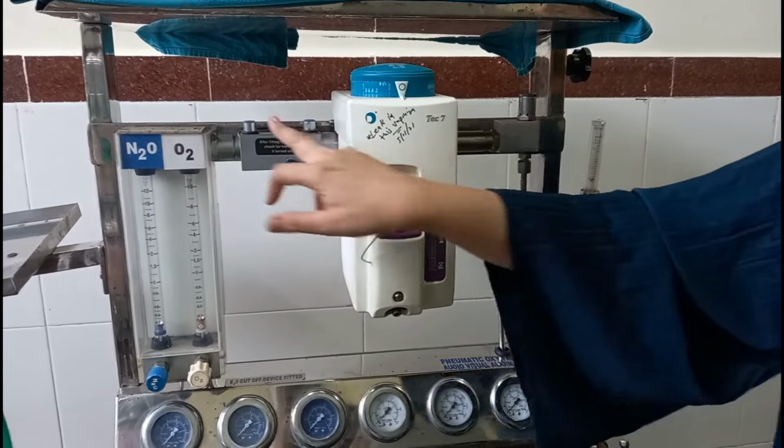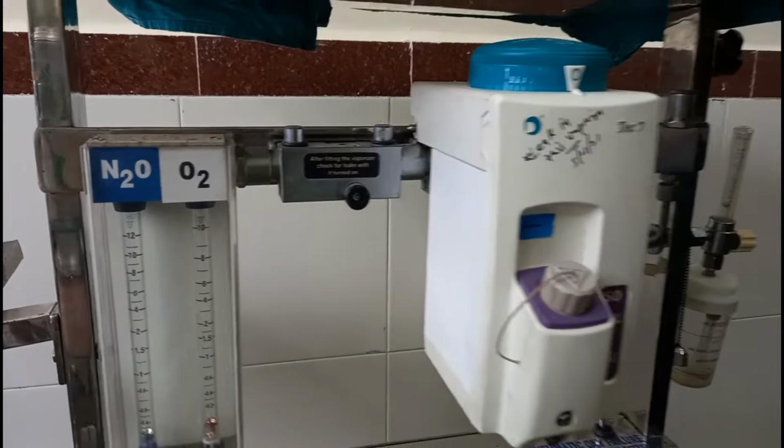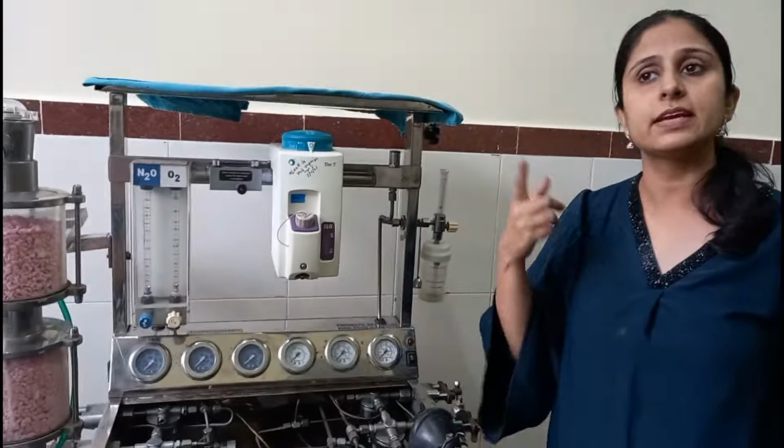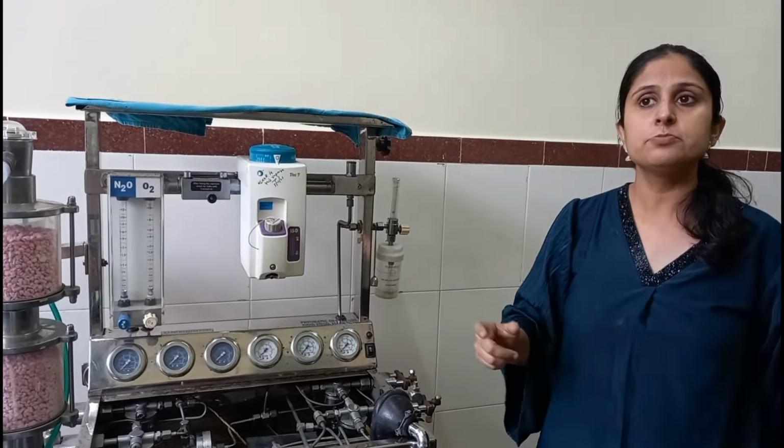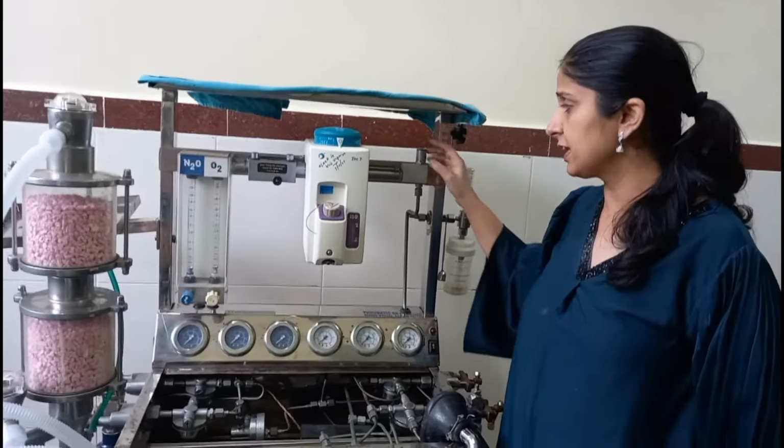Here there is a selectatec arrangement in the vaporizer. What is the selectatec arrangement? When one vaporizer is open, you cannot open the second vaporizer at the same time, which means you can open only one vaporizer at one time. So that is known as the selectatec arrangement.